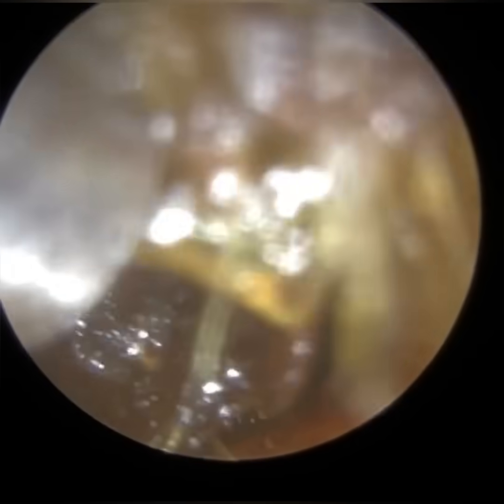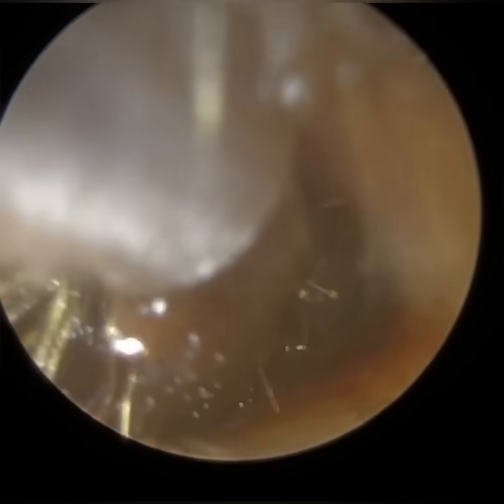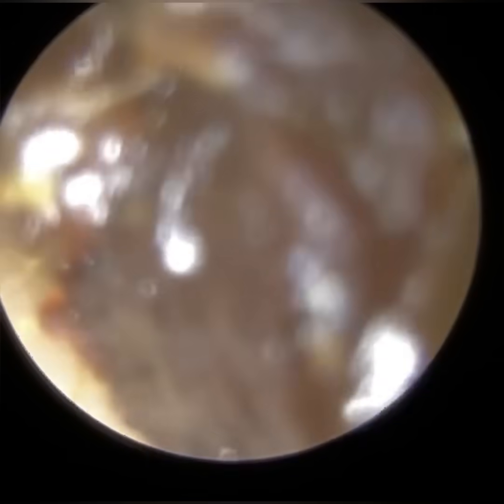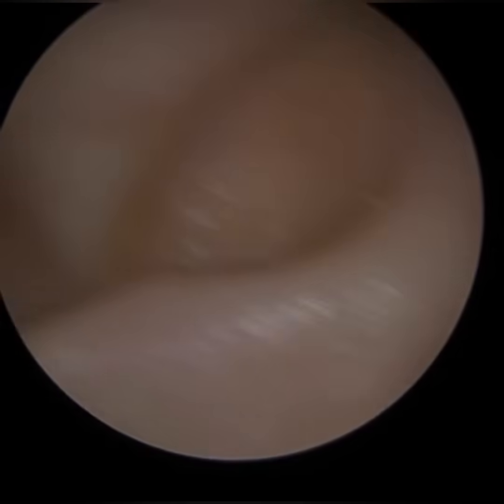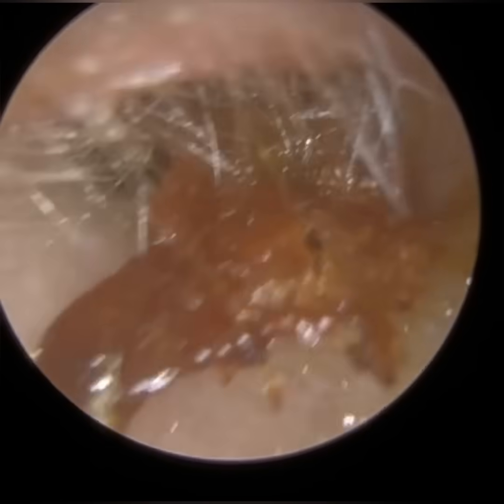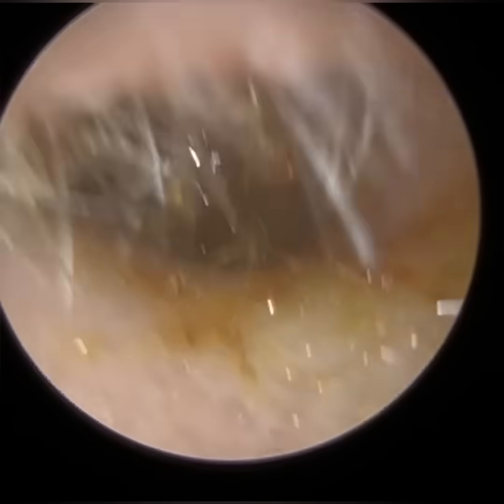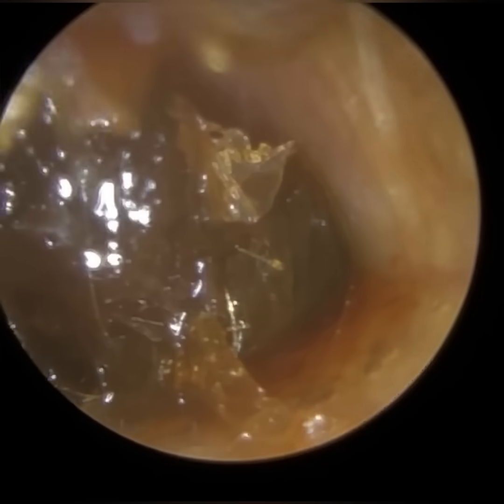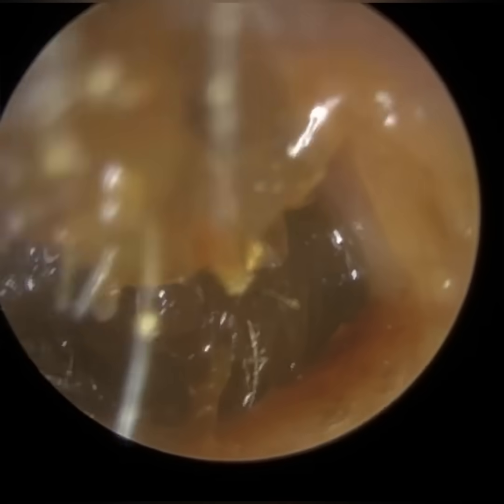With microsuction, there's no real necessary requirement. Some companies may advise using some drops a few days before, which is totally fine. In fact, when we train our Clear Wax specialists, I also advise — if it's a new skill they're acquiring — to definitely ask their patients to use some olive oil spray prior to attending, because it can help.